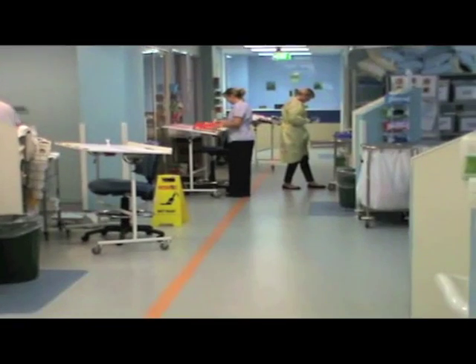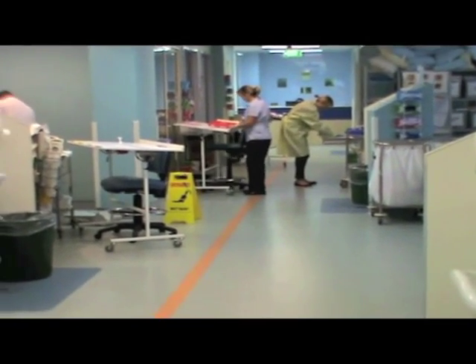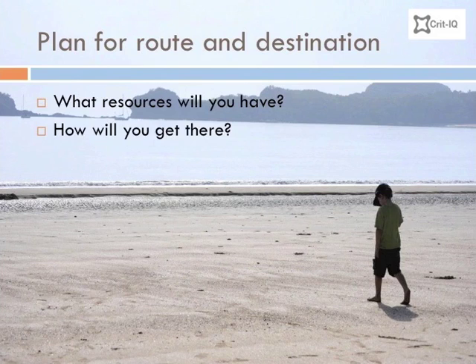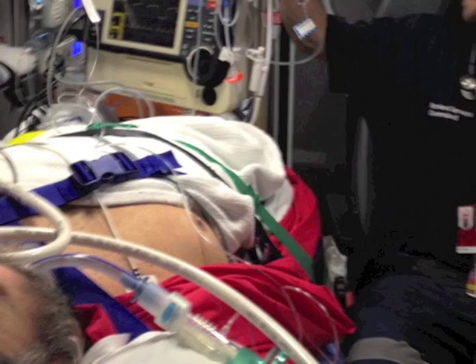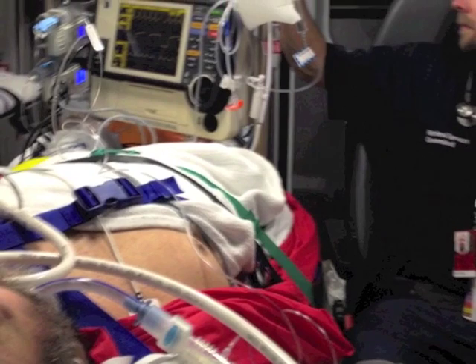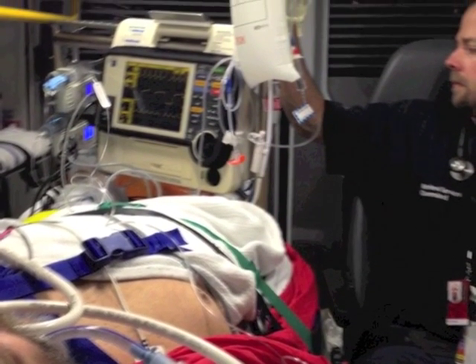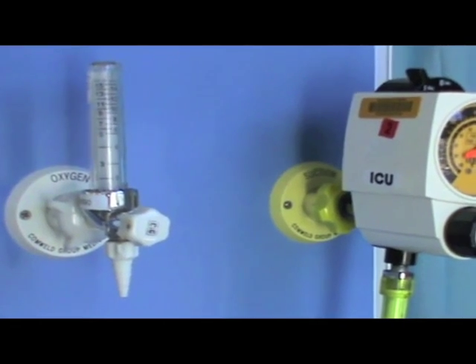You should spend time working out where you have to go. What resources will you have available to you? Will suction, oxygen, ventilation equipment, resuscitation gear and experienced assistance be available? Are there any obstructions that will prevent the journey occurring? If transporting by vehicle, make sure you're aware of the resources and layout that the vehicle will have. This is particularly true for power, gas supplies and suction.